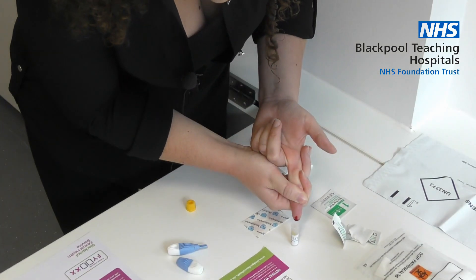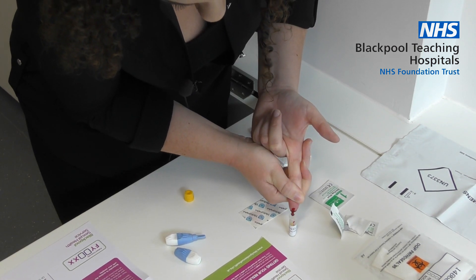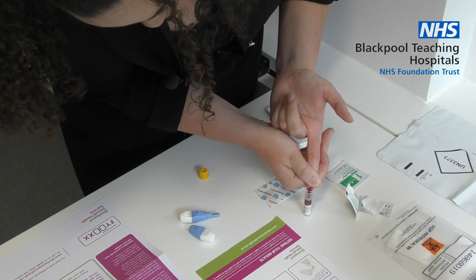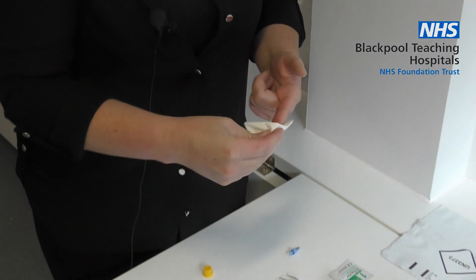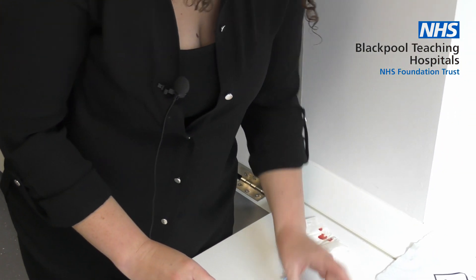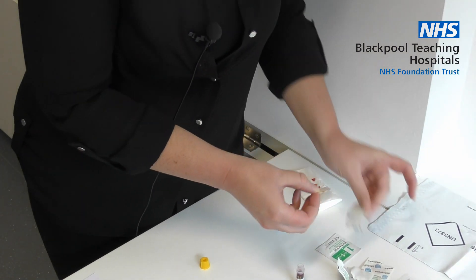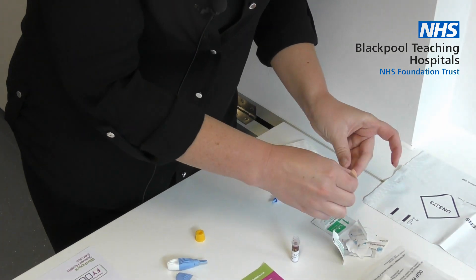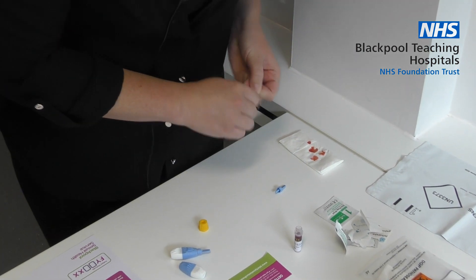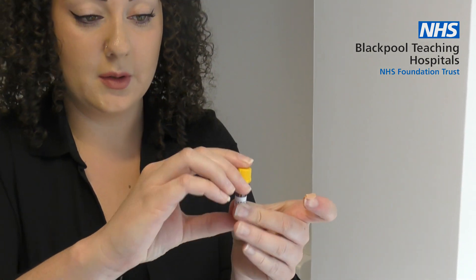It's important to fill the tube up to the 600 line. Push the lid firmly onto the blood tube until you hear a click.